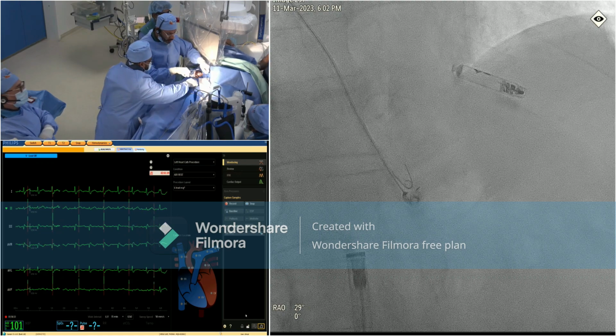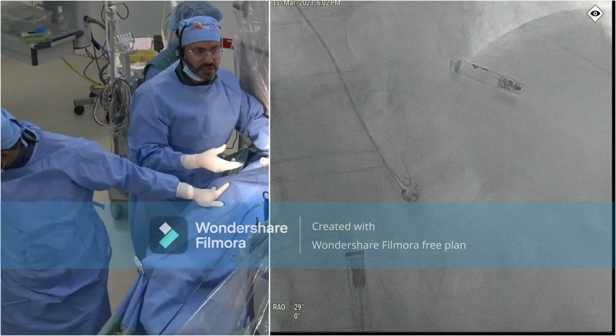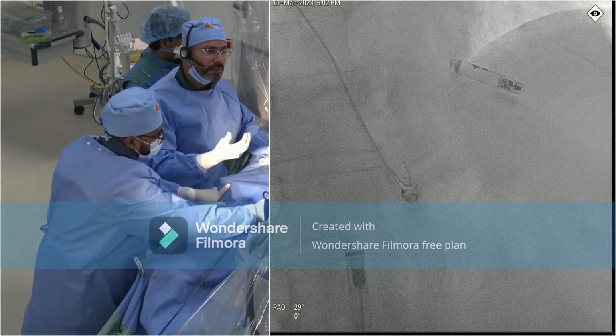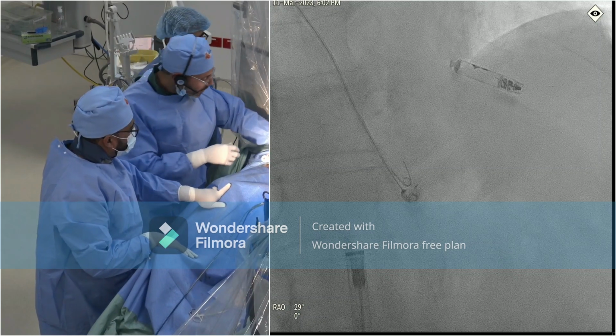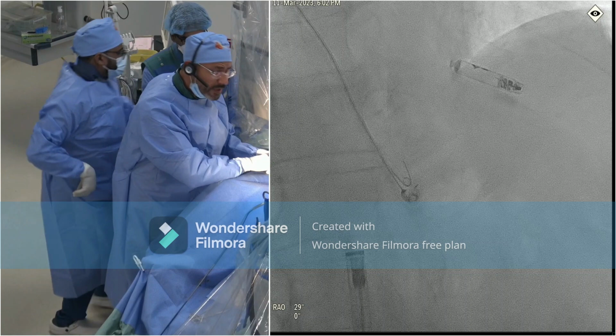And this is very good to mention because, as I mentioned, this device is upgradable. So if you put it in a patient now, after a few months, you can bring the patient up on follow-up, and if he needs an upgrade, you can put another system in the atrium. So here we tend to compress. If someone can come and help me here, compress, and we take it.